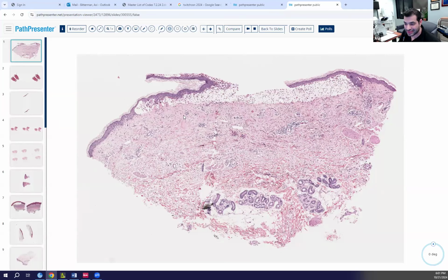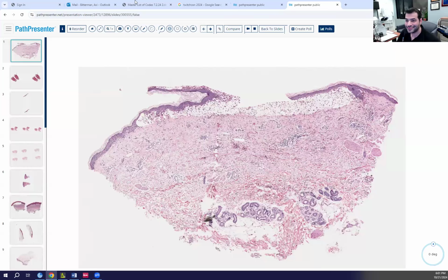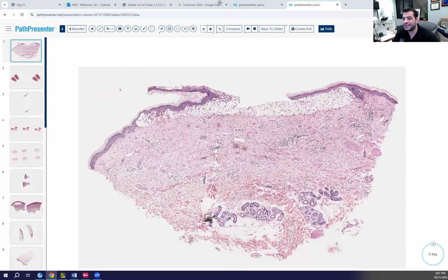Looks like someone did this biopsy. What'd they do it for? They saw a bulla. Okay, what kind of bulla did they see, now that we're looking at it on the scope? It's subepidermal. There's a moderate amount of inflammation in the actual contents of the bulla.